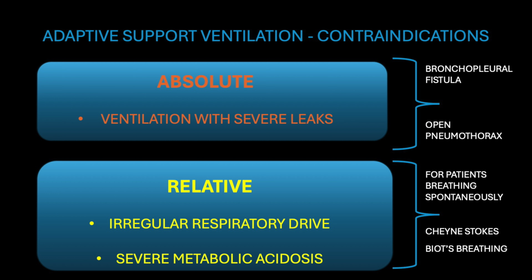Finally, in chemically paralyzed patients with severe metabolic acidosis, ASV is an option, but exercise caution and monitor for and maintain the pre-intubation end-tidal CO2 carefully.